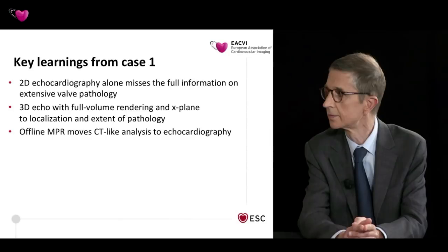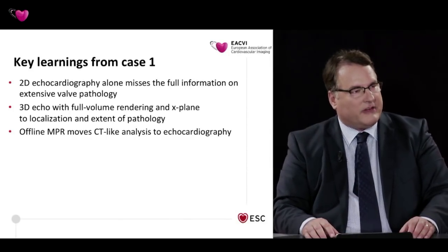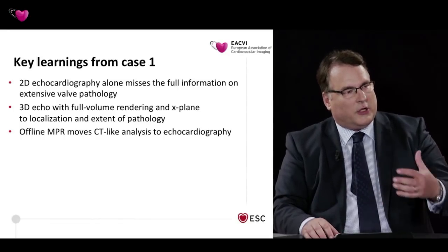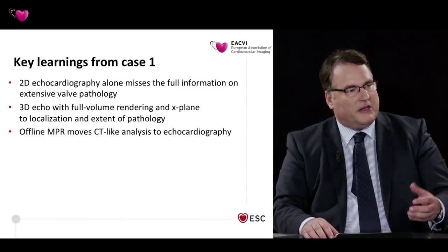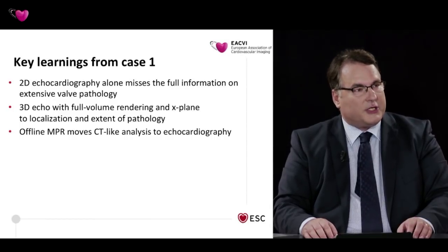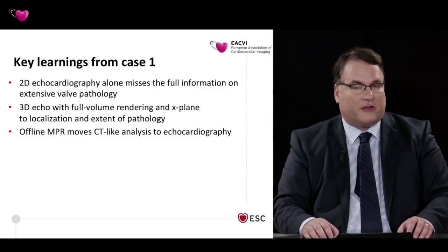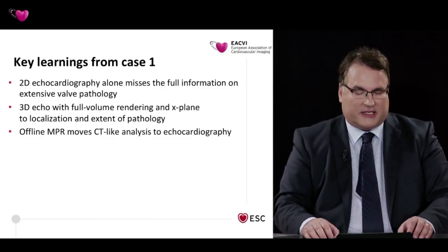And this also gives a very strong emphasis on the need to be anatomically correct, as you pointed out, so that we know where the P1, the P2, and the P3 segments really are to analyze what potential therapy alternatives we will have now or in the near future. And I think you will show another very nice case.